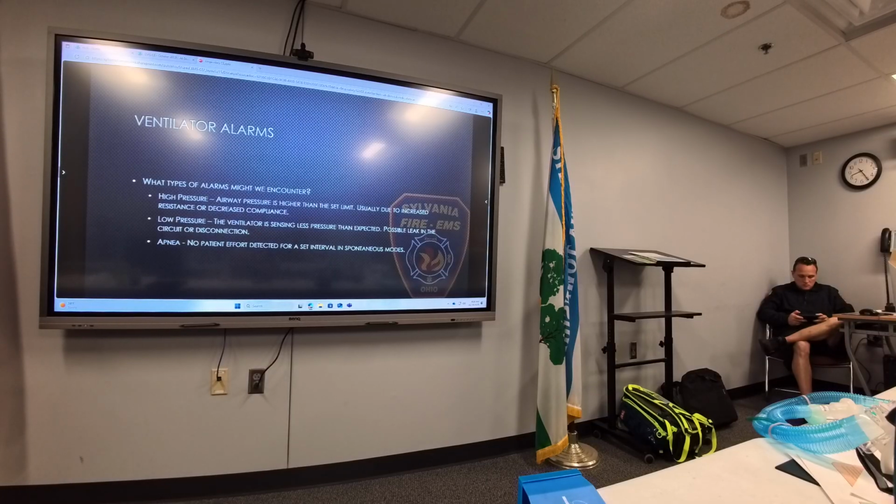Who's had a vent alarm with this? Everybody? Everybody shared. So these are the common ones that we're going to see. High pressure, so the airway pressure is higher than the set limit, usually due to increased resistance or decreased compliance.